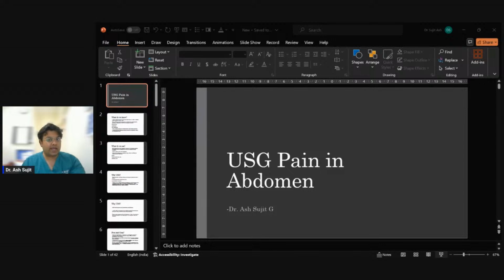Yes, it can be used for both diagnosis and for assessing the complications. Not only for the abdominal and the gynec issues, it can also be used for non-gynecological conditions such as acute pain in abdomen because of diverticulitis or renal calculi. And the last line, I'd say it's very controversial, but yes, sonologists are not always expert in their diagnosis. So when you need a differential diagnosis, you will rely on your clinical acumen and also on the imaging studies, and then you can decide the best diagnosis and the course of treatment for the same.